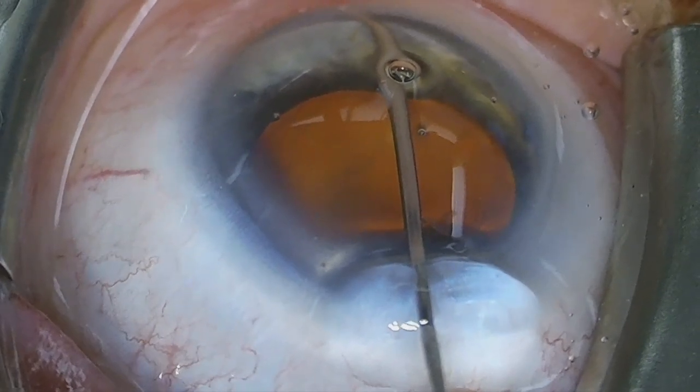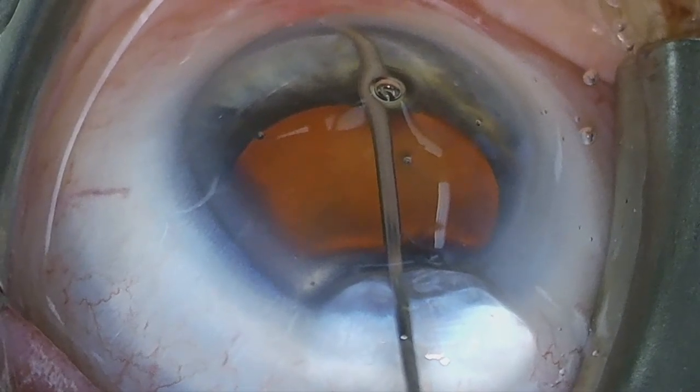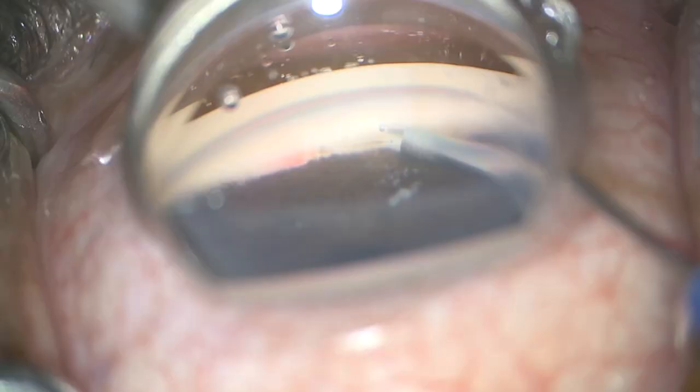Dramatic blanching of the episcleral veins can be seen. After the 360-degree pressurized canaloplasty has been completed, the cannula can be removed from the AC, and the phaco can proceed as usual. In summary, when performing canaloplasty, keep the following tips and tricks in mind.